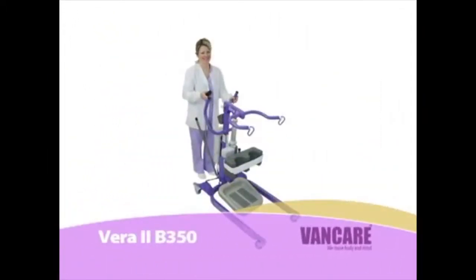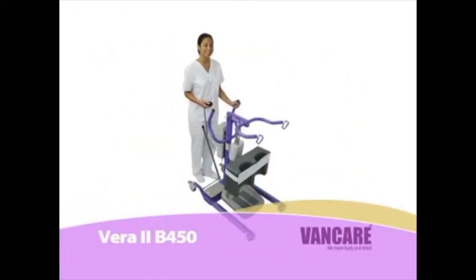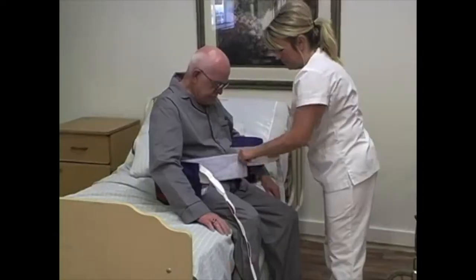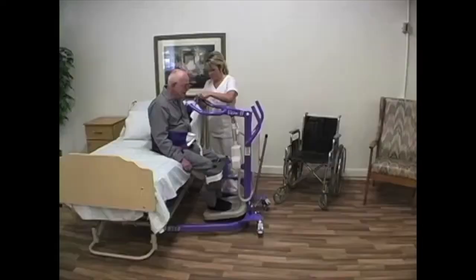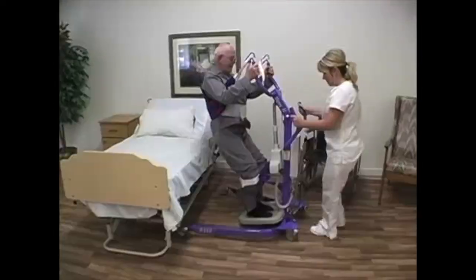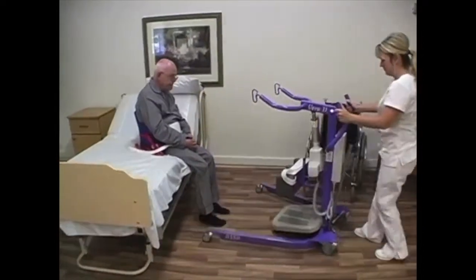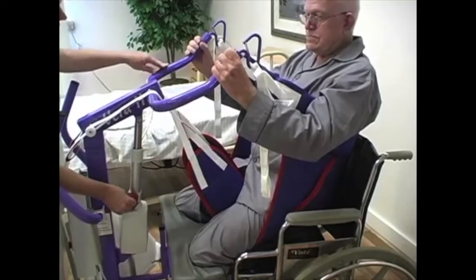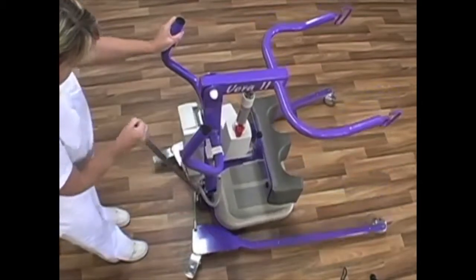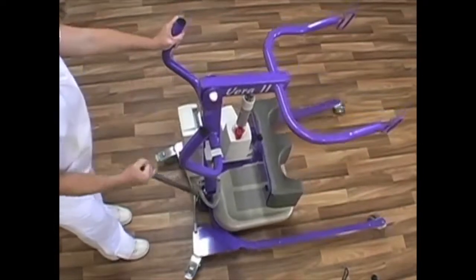The Vera 2 B350, B450, and B600 may be used to transfer clients who weigh 350 to 600 pounds. Clients who have injuries or medical conditions that could be aggravated by the lifting procedure may not be lifted or transferred with the Vera 2. This video should be used along with the Vera 2 operation manual and hands-on training led by a manufacturer's representative or by your facility's mechanical lift trainer as part of a mechanical lift education program.